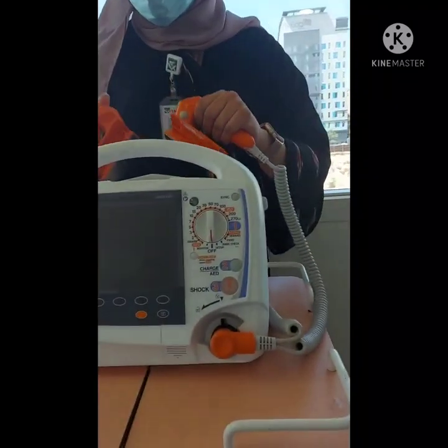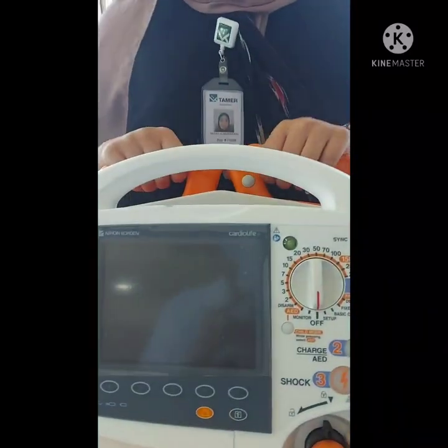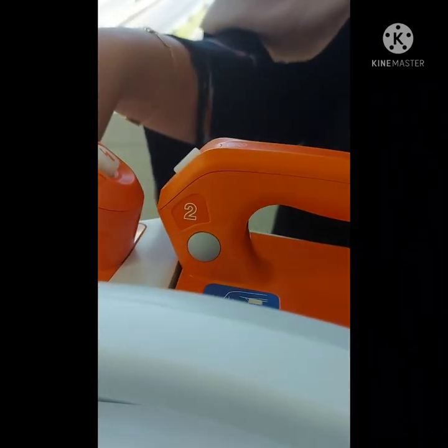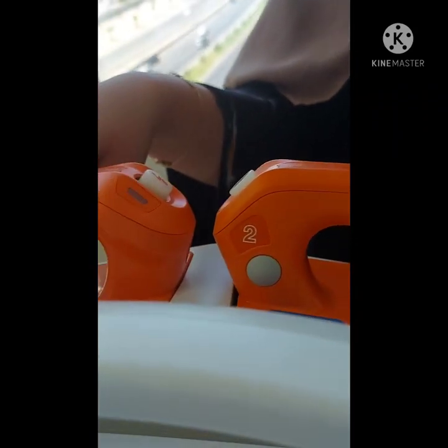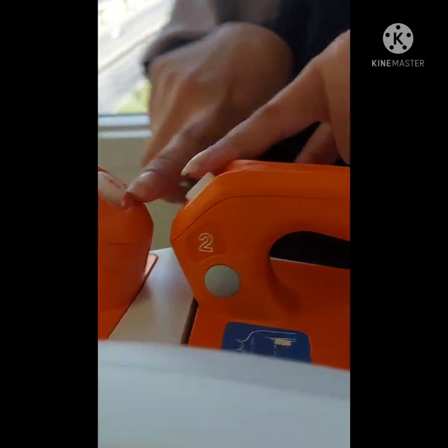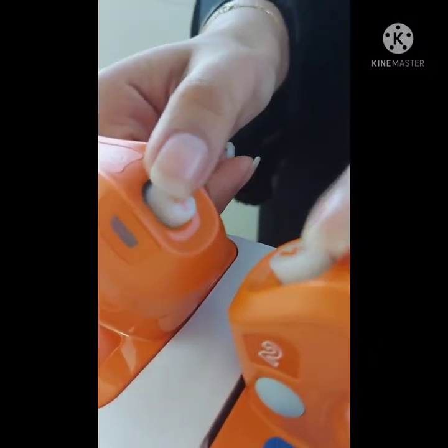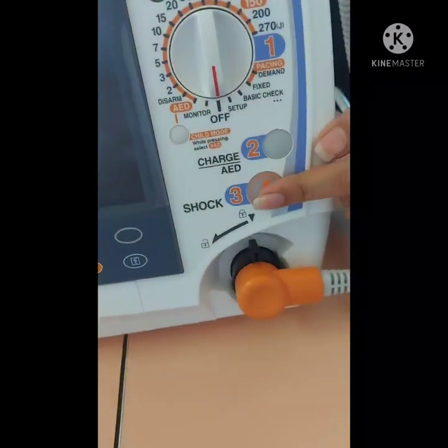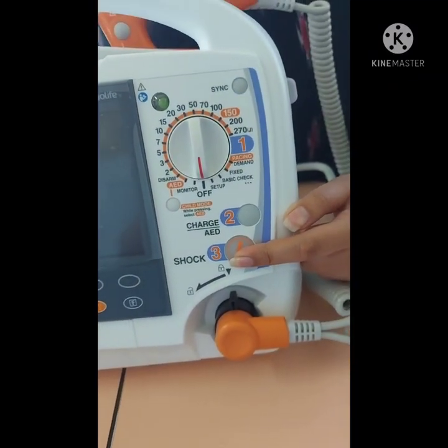Okay, so I'm just going to put it back. And you can see here, there is number 2 also here for the charging. It's the same. So you can charge basically from here or from here. And the discharge for the paddles, you have to discharge from the paddles themselves, not from here. Okay? You can discharge when you are using the paddles.